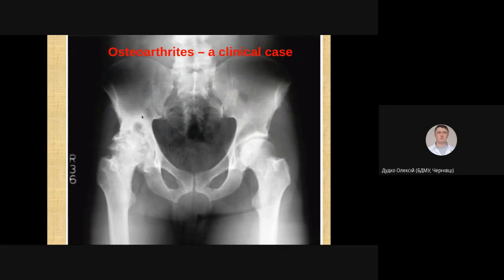We can also note a very intensive density area of the acetabulum and formation of osteophytes of the acetabulum and femoral head. So we have the fourth stage of osteoarthritis on this side.